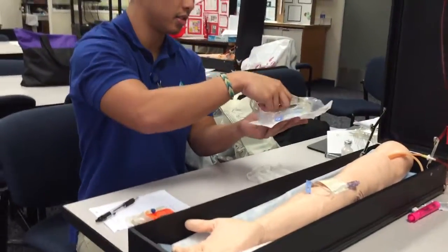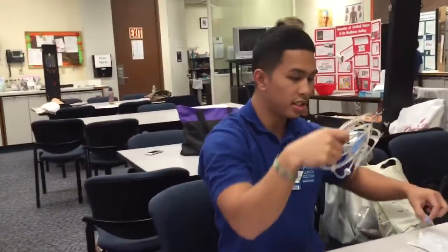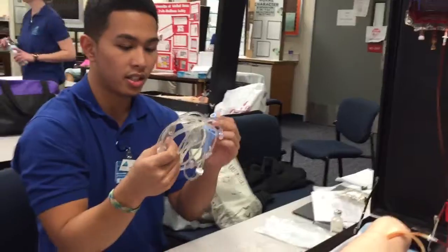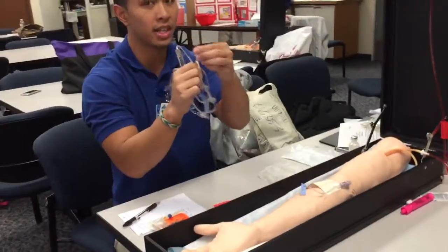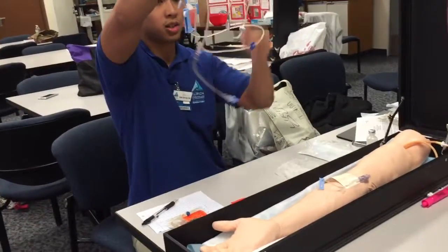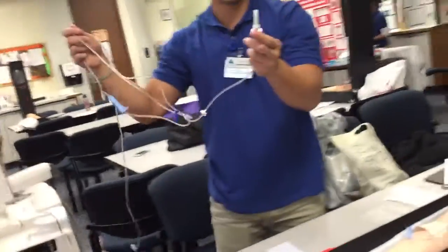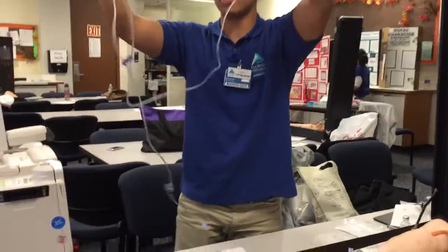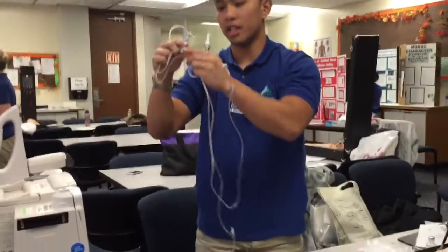And it is, let's see, this is usually on here, but since we already used it, it came off of this end, which would be a sterile end, so this would still be on here technically. So I'm going to go ahead and take all this apart. Just open it up a little bit. There's also a cover on this end, which means that that is sterile also. Going to ensure that there are no tangles or anything. I'm going ahead and clamp this off so none of the medication runs out. I'm going to clamp that off also.